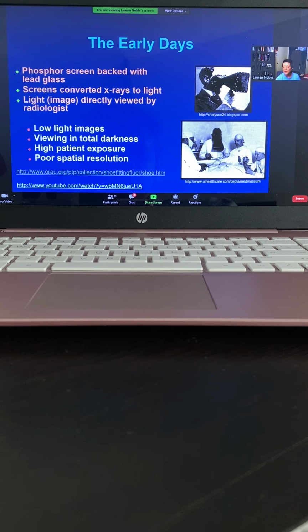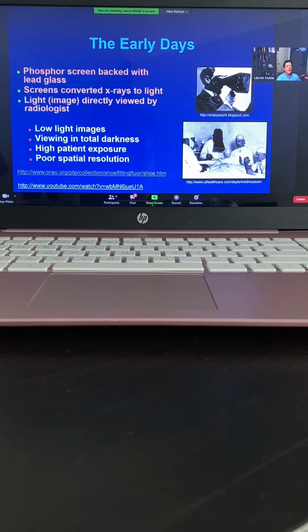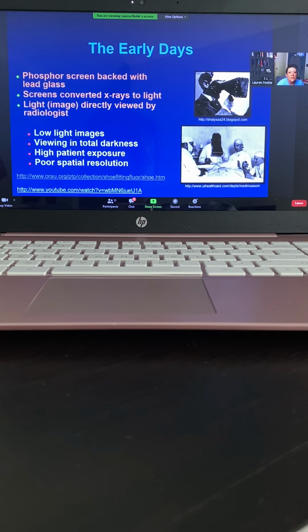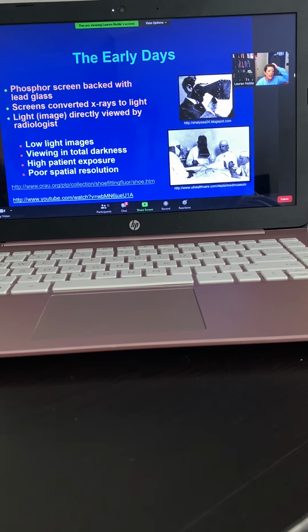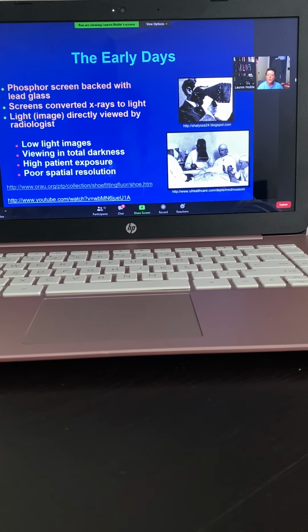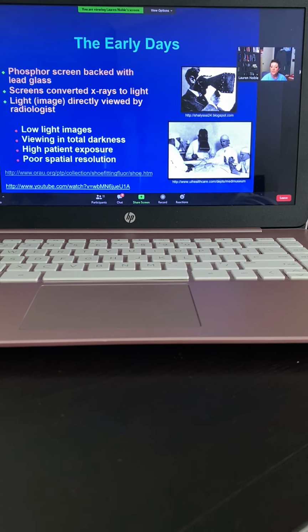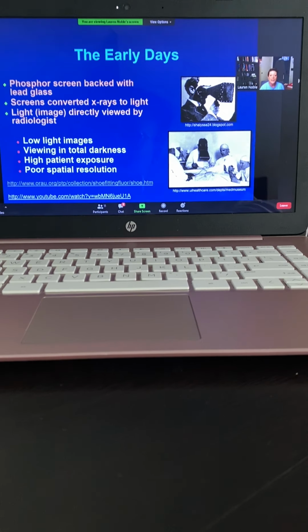So it was actually used in shoe stores, and some places still used these fluoroscopes for shoes into the 1940s and even the early 1950s. One of my grandparents remembers going to the shoe store and using this device when she would buy shoes. So when you have a moment, just look at it, because it's kind of neat to see.